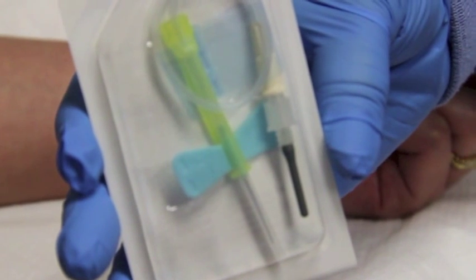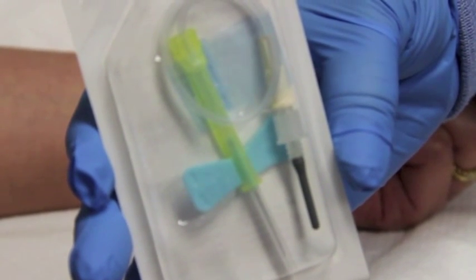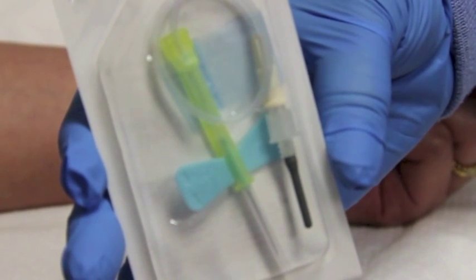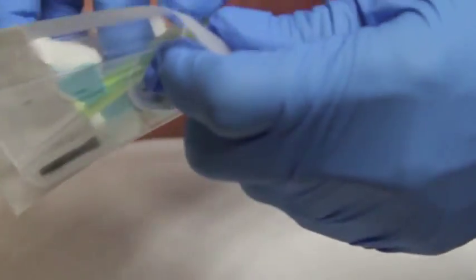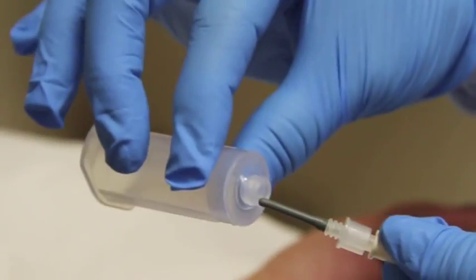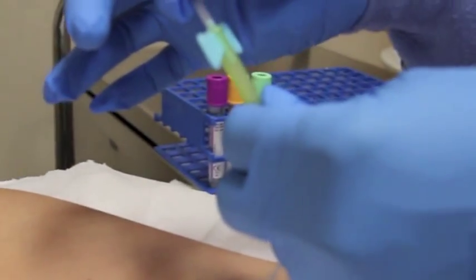The needles are stored in sterile packs and are disposable. A safety sheath covers the needle to maintain its sterility and to prevent any needle stick to the phlebotomist. The phlebotomist carefully opens the needle pack and removes it, checking visibly that all is intact. The vacutainer holder is then taken and the tubing is connected via a luer adapter. The needle sheath is removed.